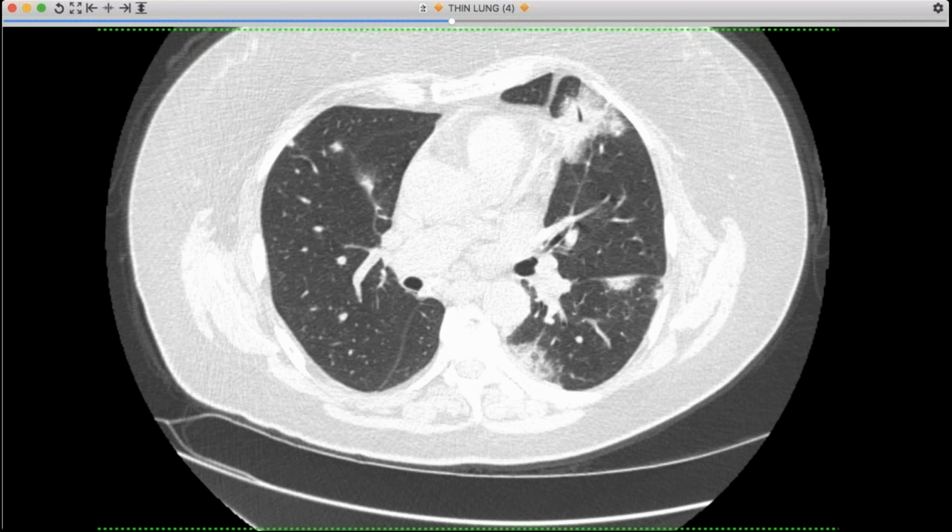They often start out as smaller lesions, like a nodule, that then kind of grows outwards and turns into the reverse halo. It's just an interesting process. I've noticed a lot of the patients that we see that have the nice, pretty reversed halos, their symptoms have often been subacute.